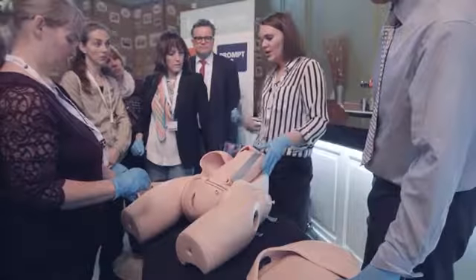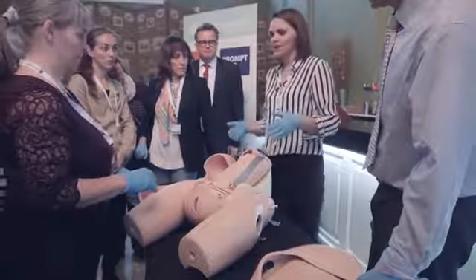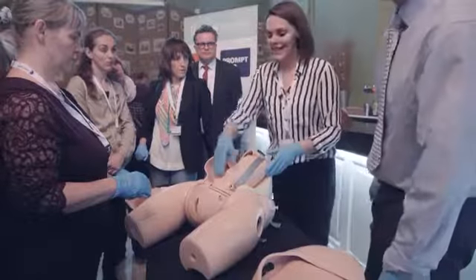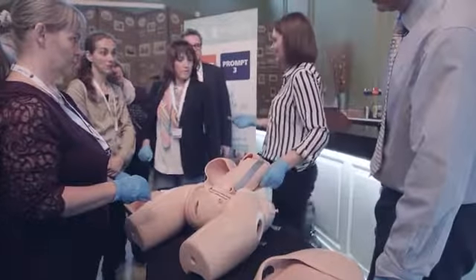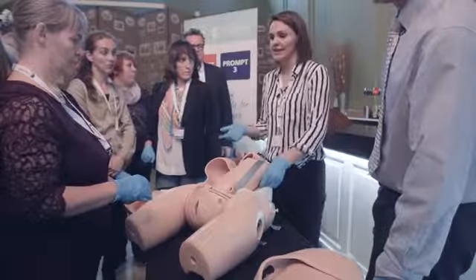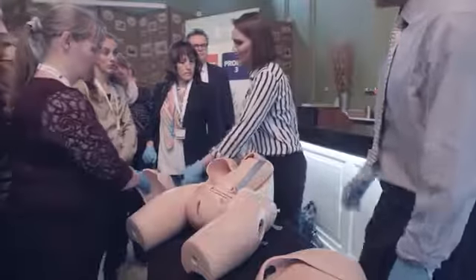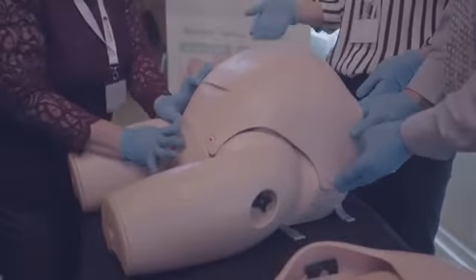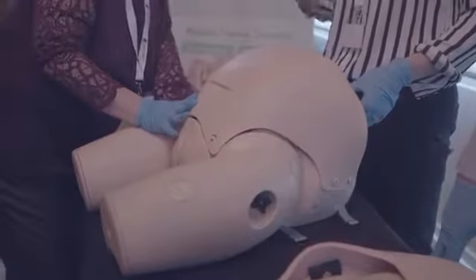And one of the things that we found is, particularly for the more junior trainees, it can be quite useful learning this with the skin off, so they can actually visualise exactly what's happening, what they're doing, and particularly for learning things like reverse breech extraction, they can see what they're doing. But I think it's pretty good to see it with the skin on, so I thought I'd just demonstrate it first. Obviously, this is not where you would be standing to do your caesarean delivery, so I apologise.